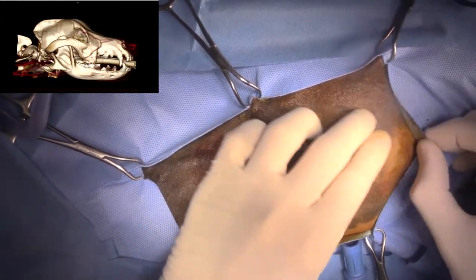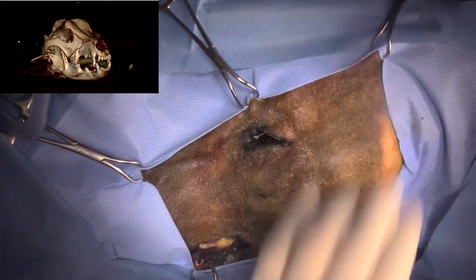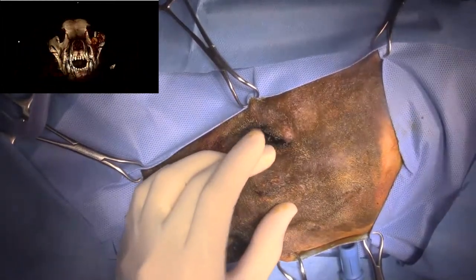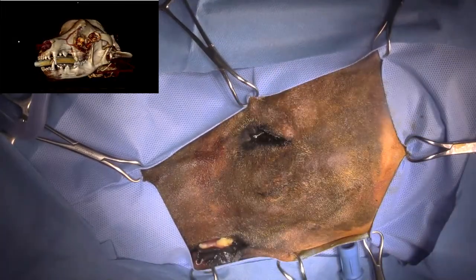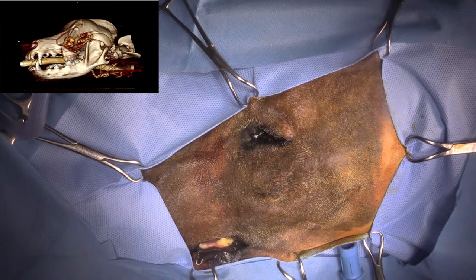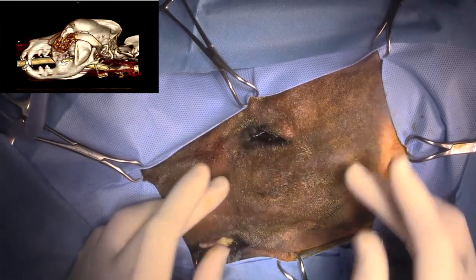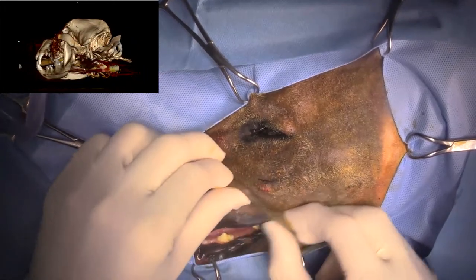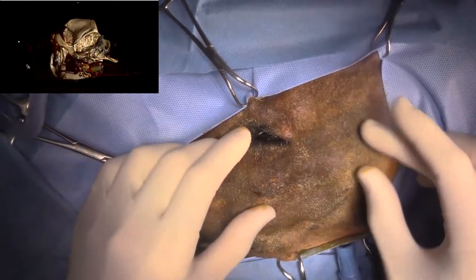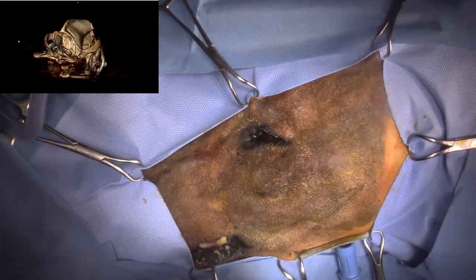Today we are operating on a large Irish Wolfhound cross that has a fibrosarcoma of the zygomatic arch right here. And you can see the CT scan in the corner there. So that's right where it is now. You can see where that mass is on the zygomatic arch, and then it's attaching to the infraorbital region of the maxilla. And so we're going to remove a portion of the zygomatic arch and also part of the maxilla here in order to get a clean margin on it.